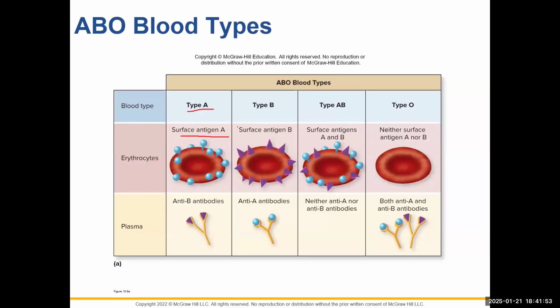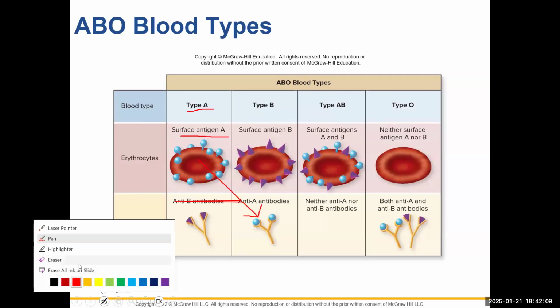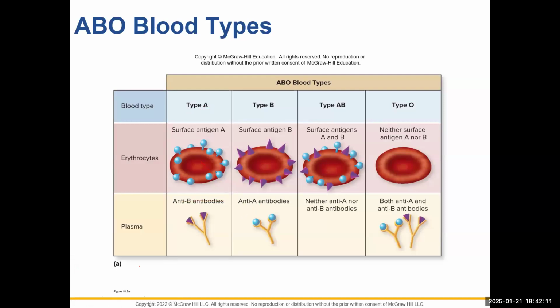That means that my surface antigen A reacts with anti-A antibodies. But if you look at this chart here, I'm only going to talk about me.